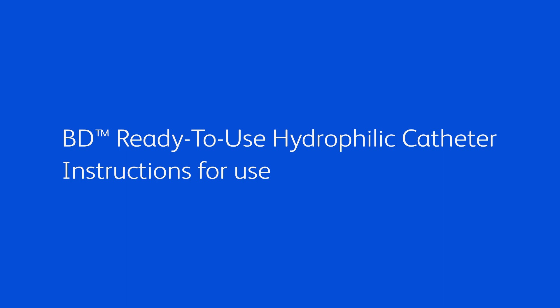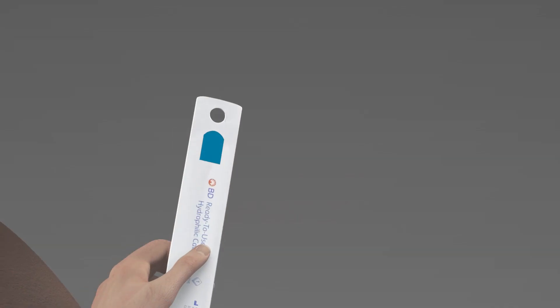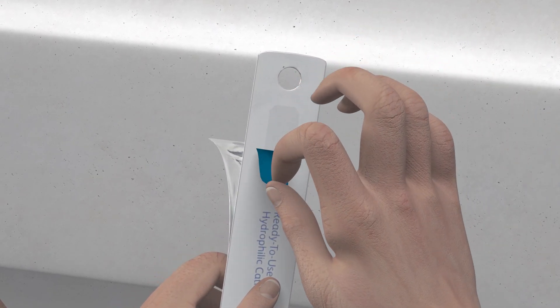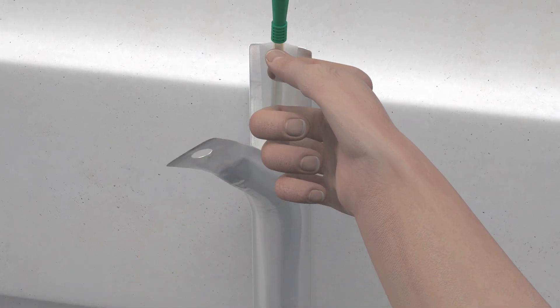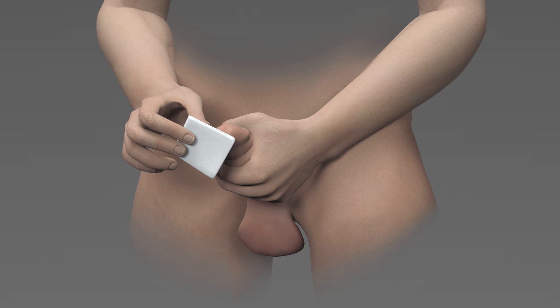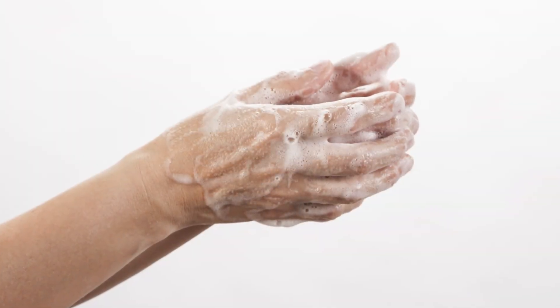Always start with washing hands before handling the catheter. To open the catheter packaging, peel the tab downwards with the aid of the finger hole. If you'd like, you could hang the package by removing the blue adhesive sticker and attaching it to a nearby dry, vertical surface while preparing to catheterize. Clean the opening of the urethra and surrounding area. You can use soap and water or an alcohol-free wet wipe to do this. Wash your hands again.